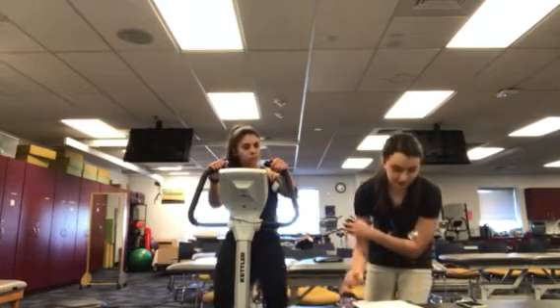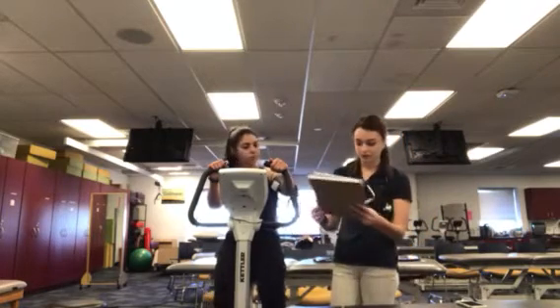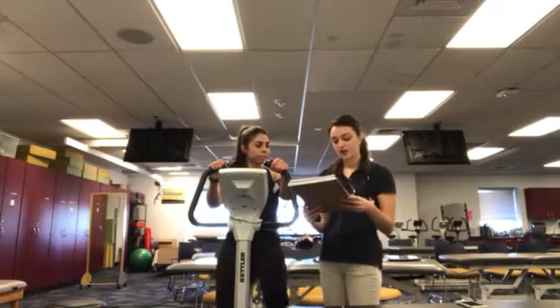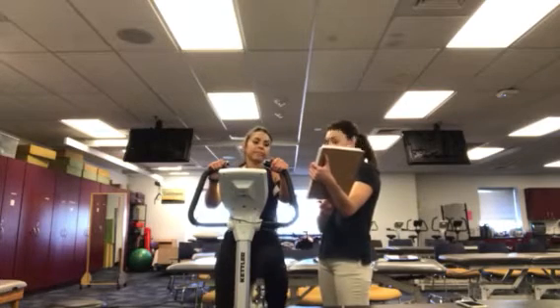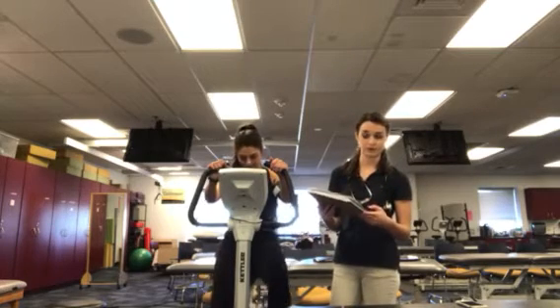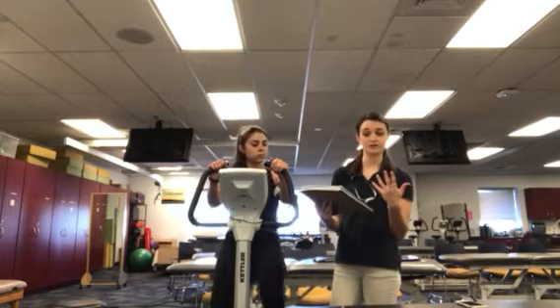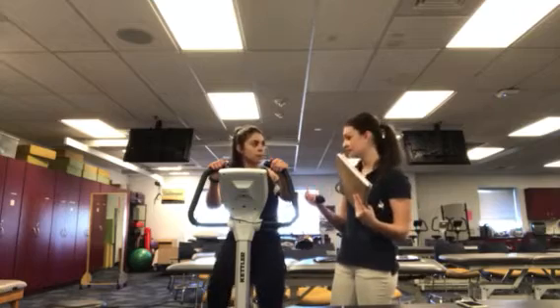So the measurements that I just got for Brooke: her first heart rate was 140 beats per minute. Her blood pressure was 130/74 millimeters of mercury. And Brooke, how are you feeling on that RPE scale? A 9. Perfect. Brooke's RPE is at a 9. And the second heart rate that I got for her is 143 beats per minute. So that 140, 143, we are within 5 beats, which is what we needed to attain steady state heart rate, which means we can proceed with the test.